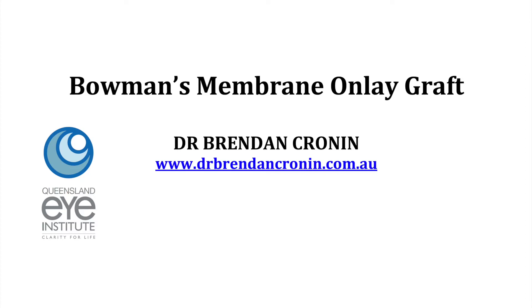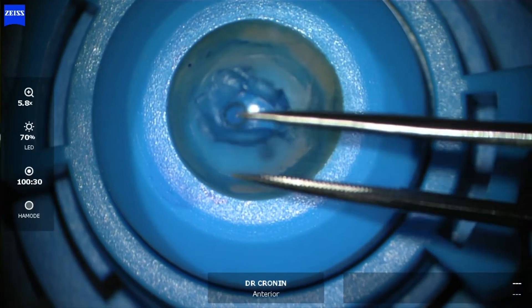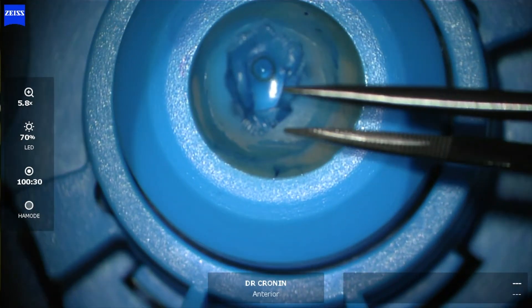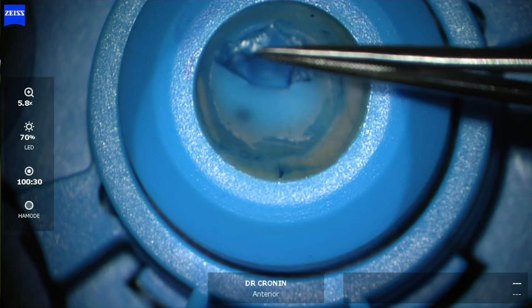This is Dr. Brendan Cronin from the Queensland Eye Institute demonstrating the technique of Bowman's membrane onlay grafting, which is used for diseases of the cornea where the cornea is weak or ectatic — either due to keratoconus, pellucid marginal degeneration, radial keratotomies, or other conditions.